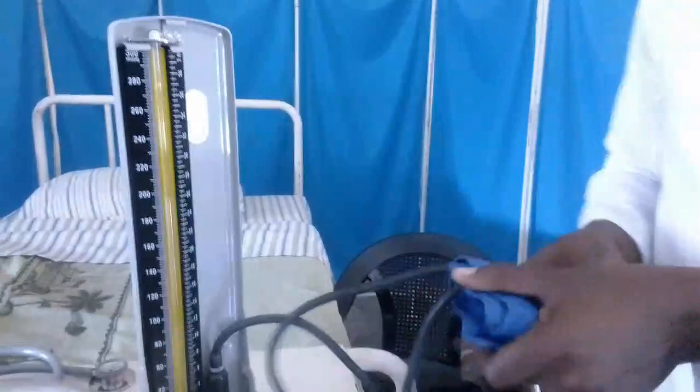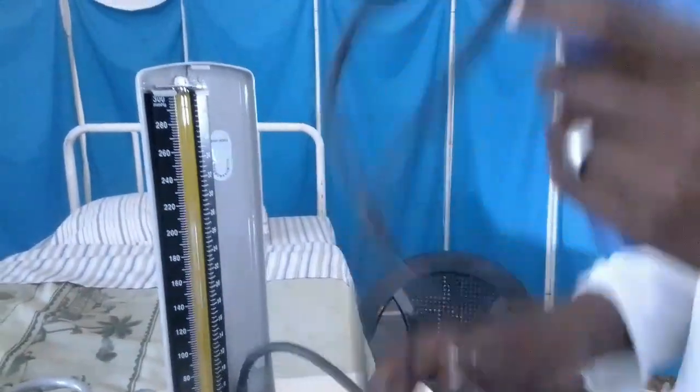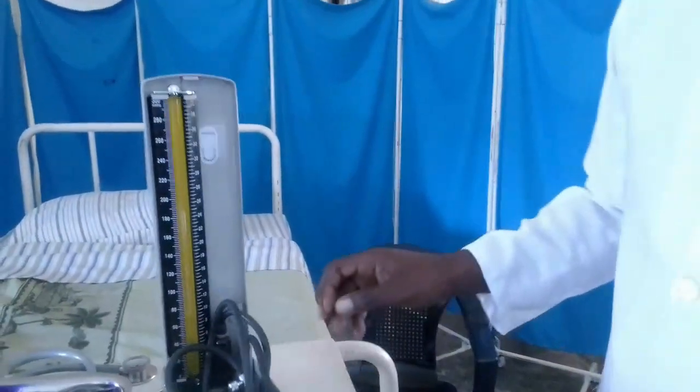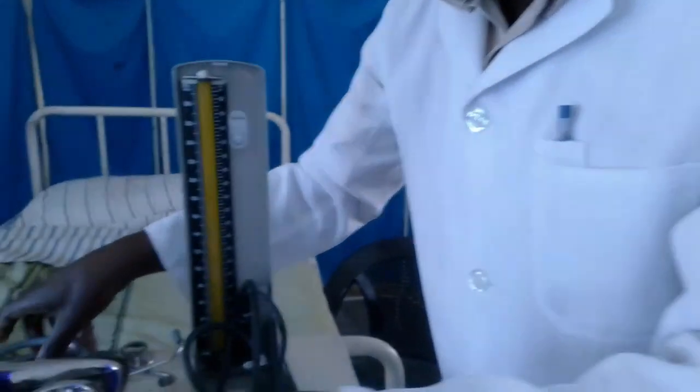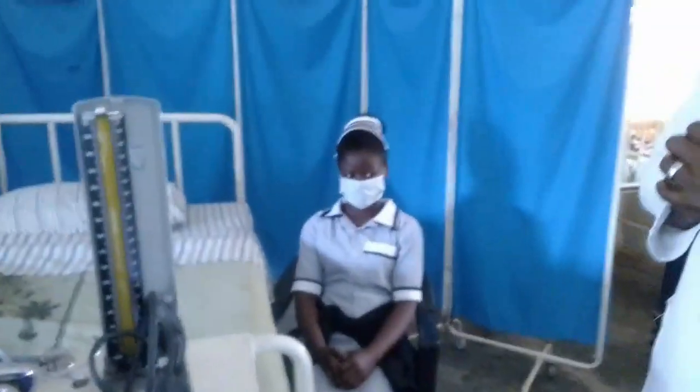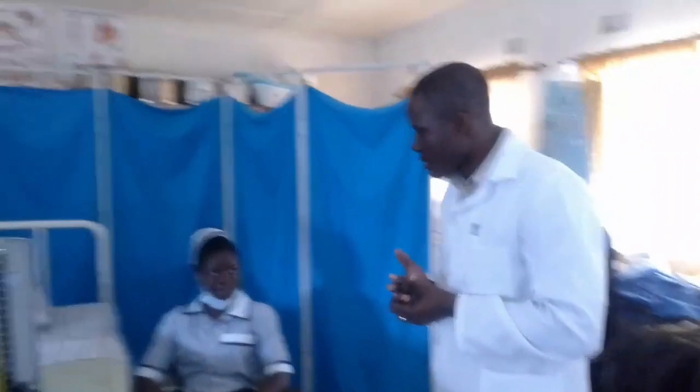Now let's try to do it on an actual patient. I've got a patient here with me. We are going to do vital signs. I don't know her names and everything, so I have to go to the patient. Good morning. Good morning. My name is Silwaba Collins, meaning you have to introduce yourself. That's after you've done your hand washing and then you come here.